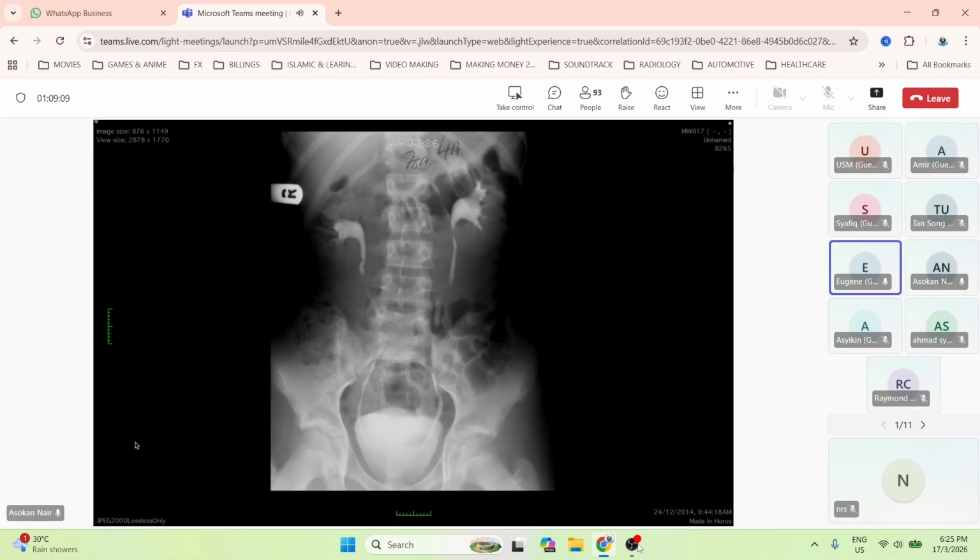The right side, the renal pelvis also appears to be pushed downwards. Maybe there could be an obstruction. And the upper moiety size? The size is smaller than the left. You don't see the upper part at all. See, it's just this size alone, something not right.